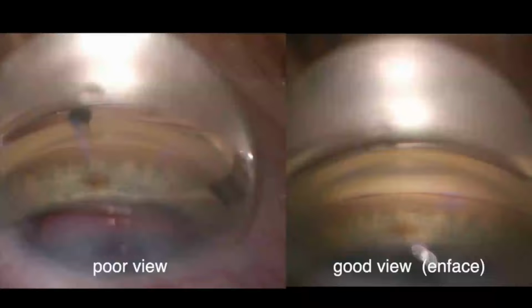And as I show you this comparison picture, on the left is the first view, and on the right is the view we just achieved by turning the head more. You want that en-face view during the entire procedure, to be as perpendicular to the TM with your loader of the iStent. So now I'm introducing the iStent to the eye, retracting the sleeve, and now I'm going to turn my hand a little bit more.